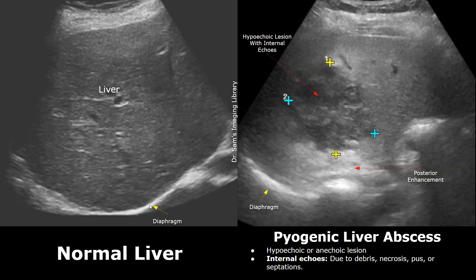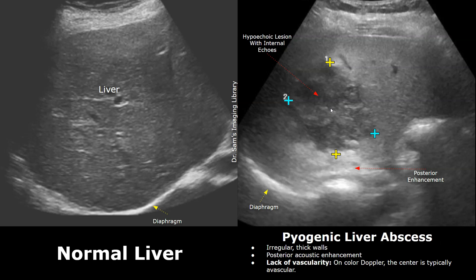Most abscesses appear as hypoechoic or anechoic lesions — dark areas compared to normal liver tissue. They are filled with medium-level internal echoes, which gives them a heterogeneous appearance. The internal echoes are due to debris, necrosis, pus, or septations. The abscess can also have irregular thick walls, and it will always have posterior acoustic enhancement. This bright area behind the abscess is the enhancement.